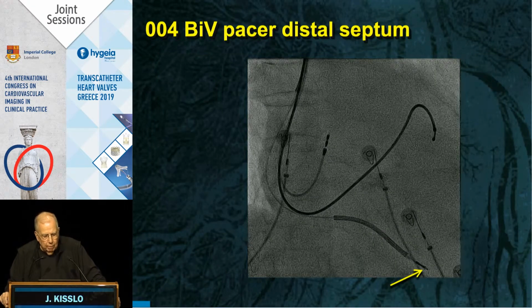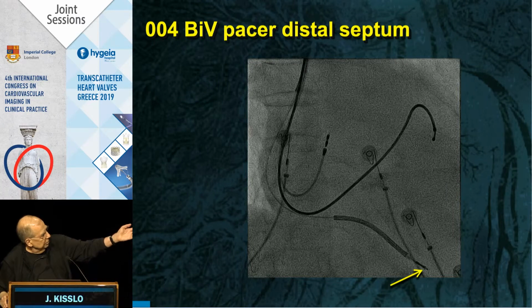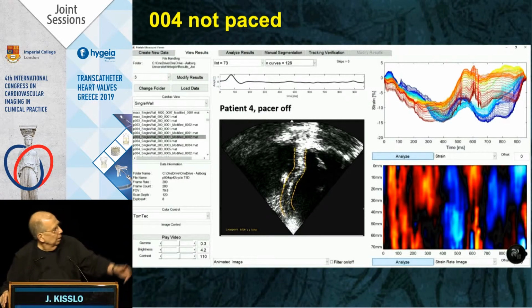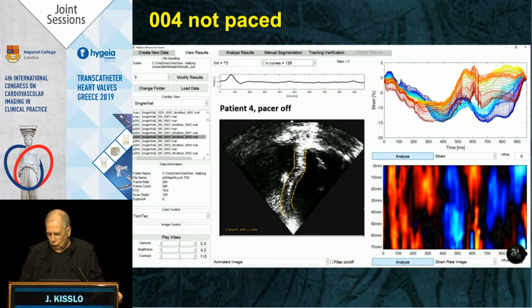It gets even more complex than this. Trying to image, do we see the coronary flow? And these images will be very complex. We look at a pacemaker tip. Here, a pacemaker tip is inserted in the right ventricle near the apex. And when we do this, now we can do lots of strain mapping and what moves first. Now you see apex at the bottom. All those curves just mean when does the wall move. This is done at extremely high speed.